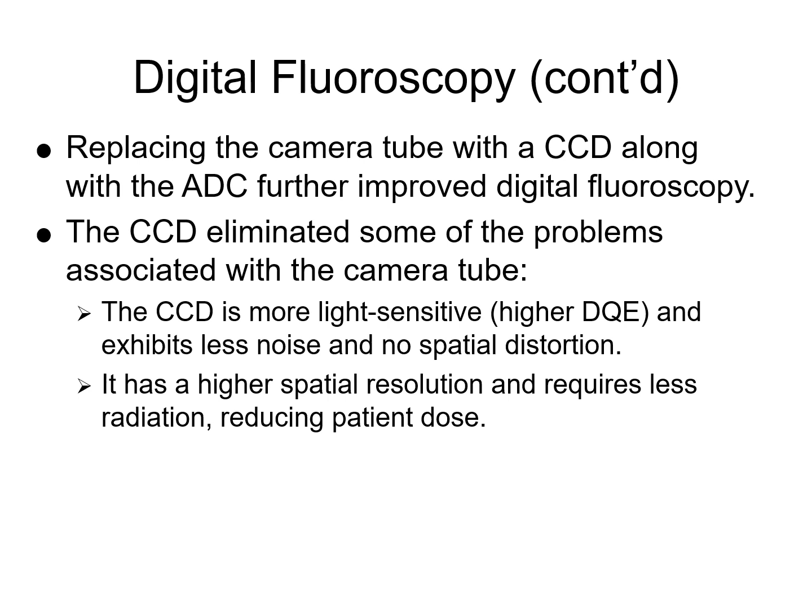The CCD is more efficient than previous technology. There's less noise associated with operating a CCD. And there's no spatial distortion. The trouble with the Vidicon Plumicon is it's got kind of a fisheye lens or a pin cushion type distortion where the far corners are kind of warped. It kind of presents what would be a flat image as a convex curved image, okay?